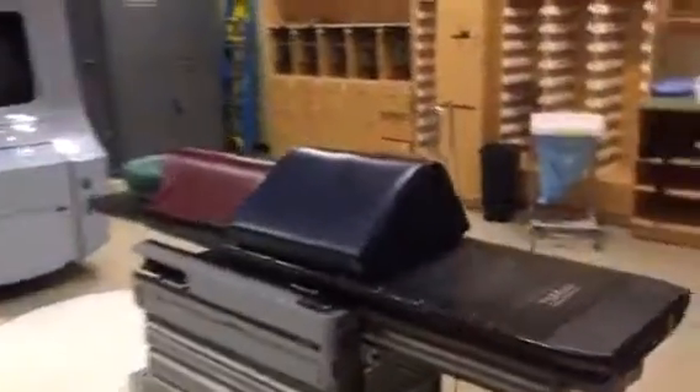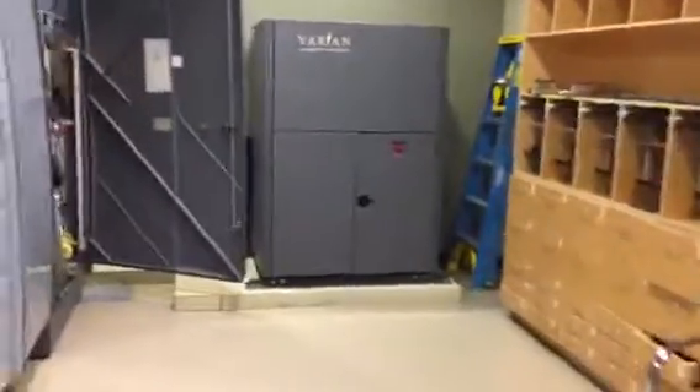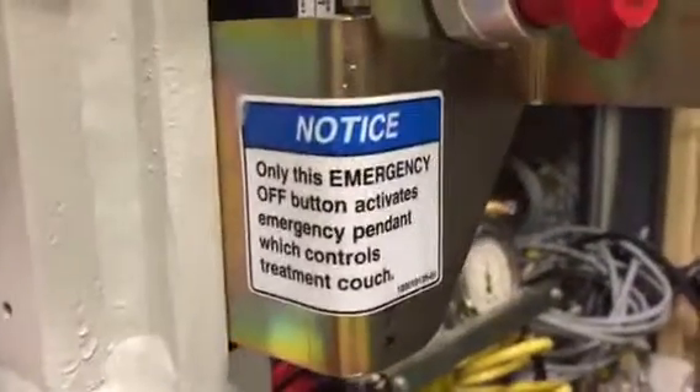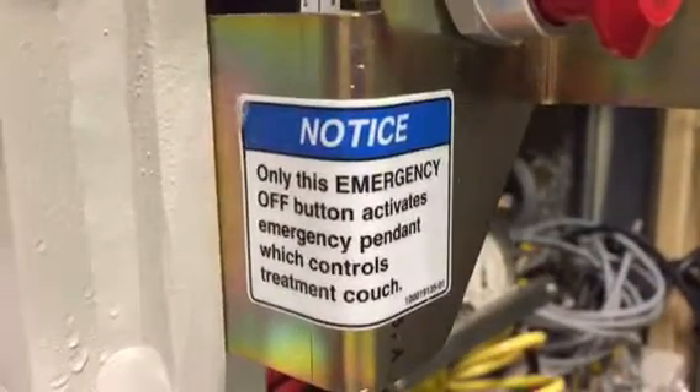Somebody hit the emergency off switch. It's Saturday at 3 o'clock and the RTSTs are not around. Open the door on the right side of the stand and you'll see the emergency off switch, labeled with a sign that says: notice, only this emergency off button activates the emergency pendant. Push it in.